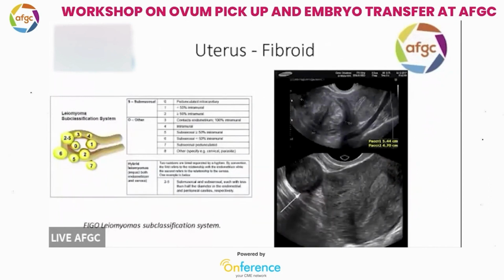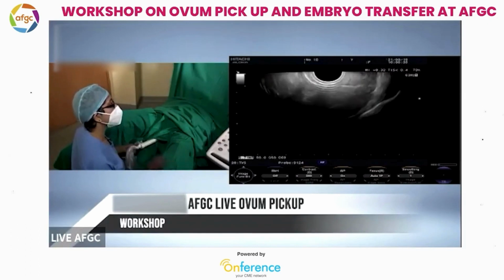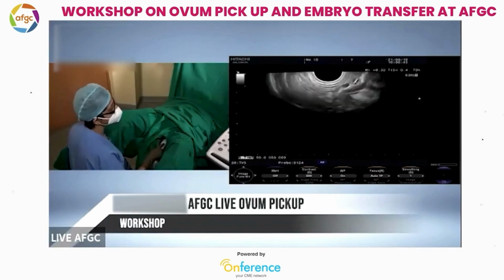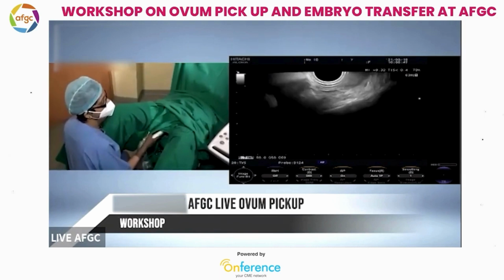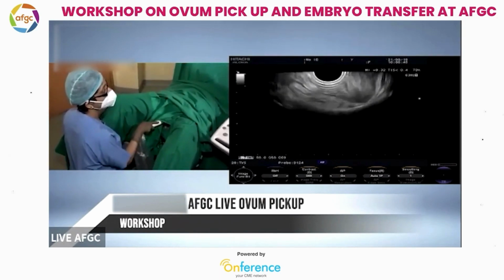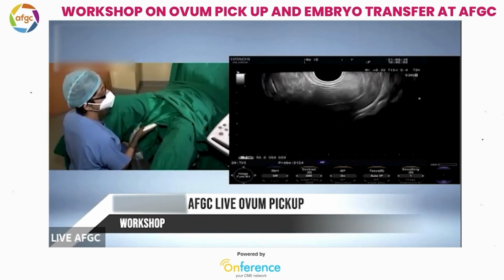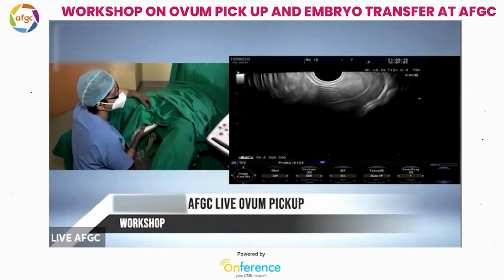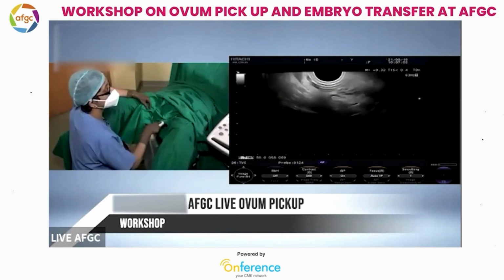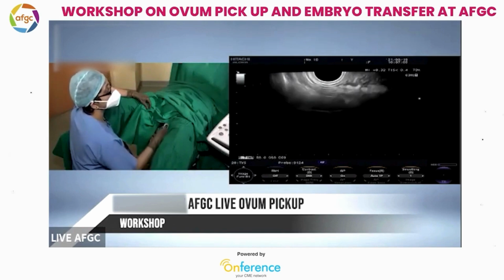Let's see what our next patient has in store. Hydrosalpinx, we have discussed, is one of the important findings which changes the IVF outcome significantly. The ways in which we can pick up the hydrosalpinx is either a fluid in the endometrium or a cogwheel or a tobacco pouch mass in the adnexa.